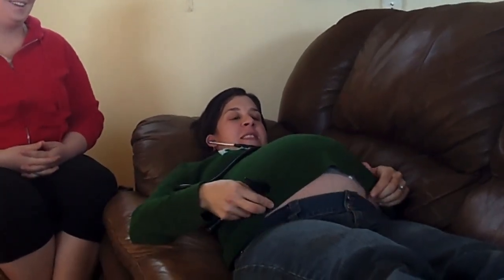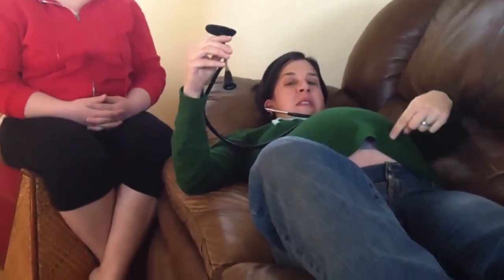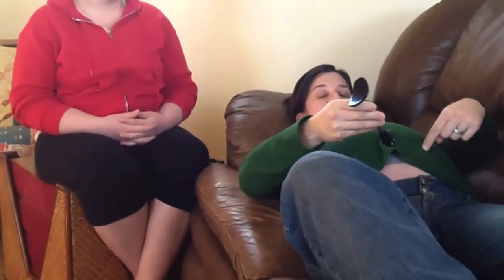But you, of course, can feel. Right, so nice contraction here. Anybody want to see a contraction? It's hard to listen through a contraction sometimes. It's also hard to feel your own belly, just because everything feels firm. It's hard to determine position. So you can wait till it goes away, which will happen in a minute or so. Or I can just go for it because I know precisely where my baby is, which is here, and the back is over on this side. So presumably if I put it right there, I will hear a strong heartbeat. And if I kept listening, I would probably still hear sort of echoes or a chord, but it wouldn't be quite the same sound.